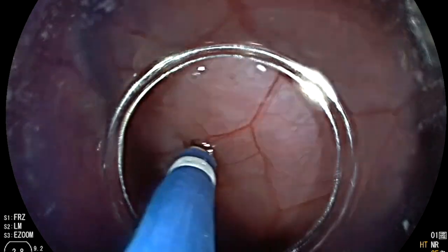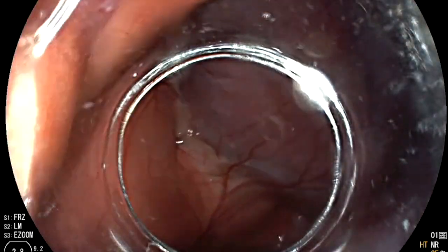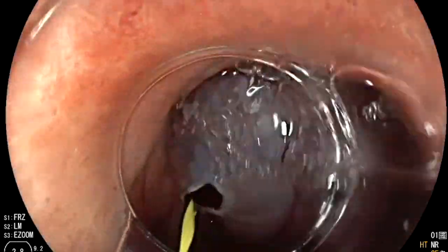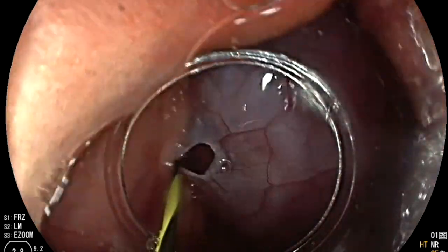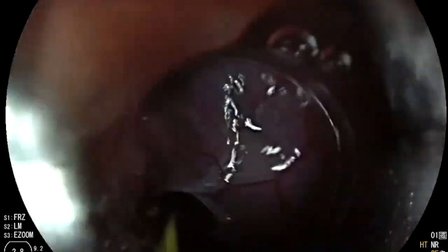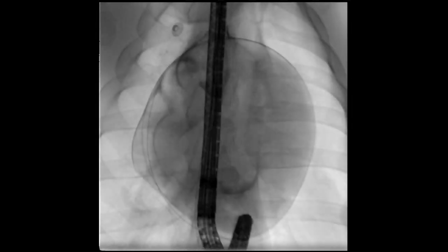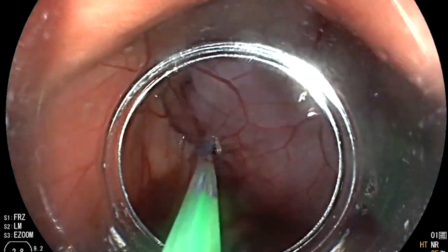We extend the opening in the pericardium with cautery after it has been safely lifted off the heart, and insert a JAG wire into the pericardial space. This is well tolerated without any arrhythmias. Here you can see the wire positioning under fluoroscopy guidance. We then pass a catheter over the wire into the pericardial space to establish catheter-based epicardial access.